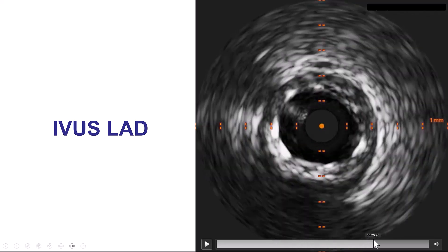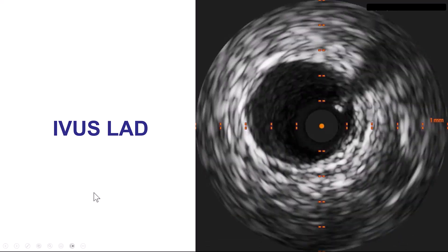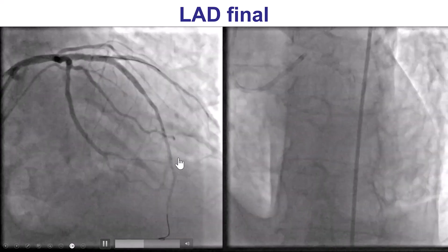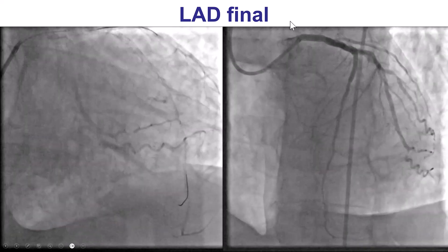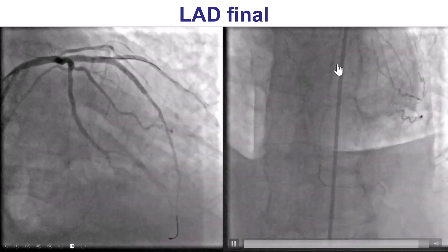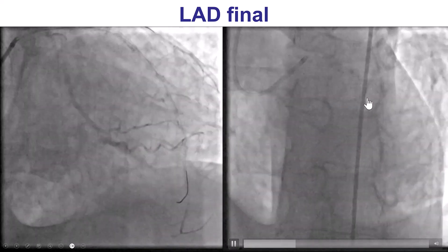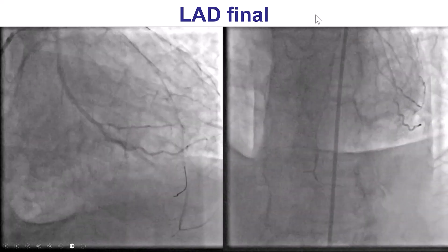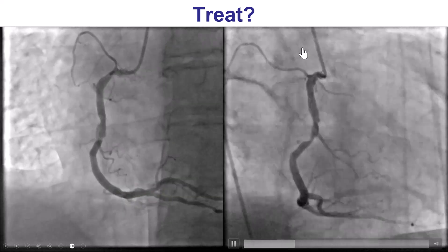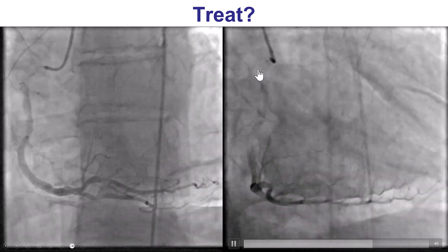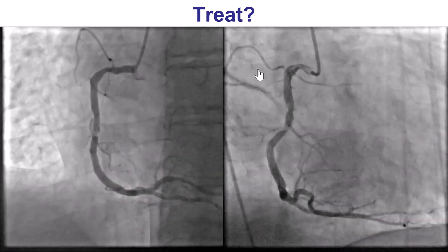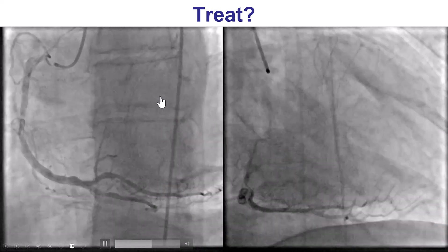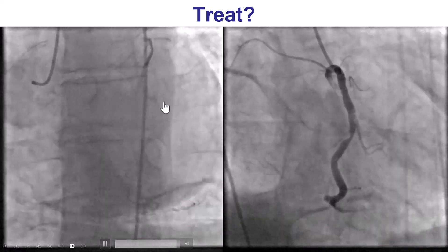We do have well-expanded stents in the mid-LAD all the way to the proximal LAD. This was the final result — very good TIMI flow in both the diagonal as well as the LAD, and the patient remained stable throughout the procedure. However, he continued to have chest discomfort. Although there was some improvement, he continued to have significant chest discomfort, and the question was about treating the right coronary artery.